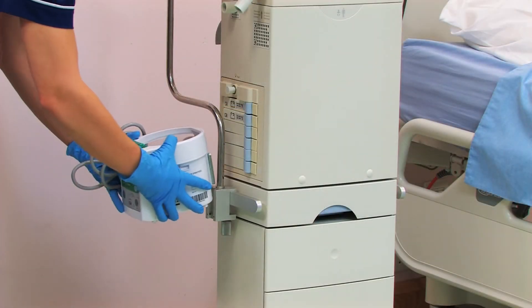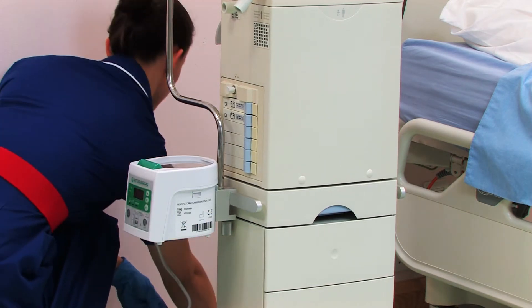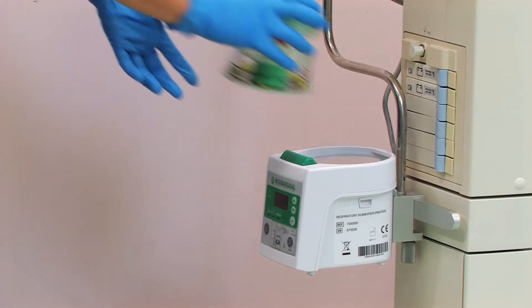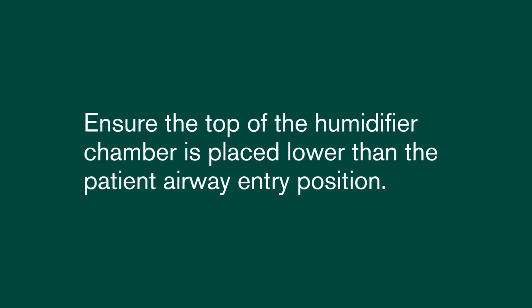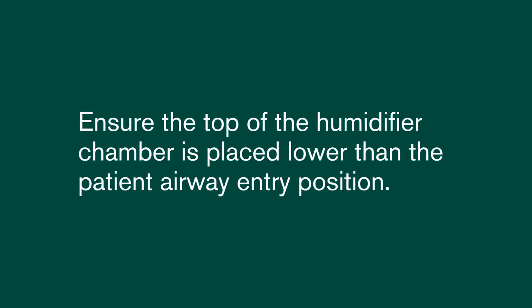First put the humidifier into the ventilator bracket and connect to the mains. Place the humidification chamber onto the humidifier and ensure it clicks into place. Ensure the top of the humidifier chamber is placed lower than the patient airway entry position.